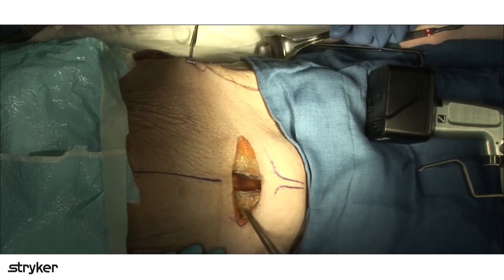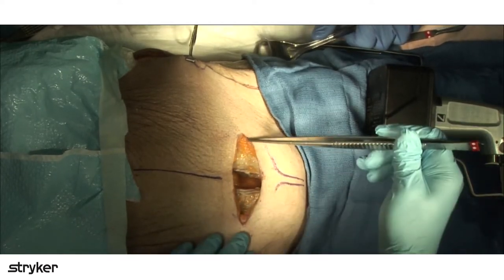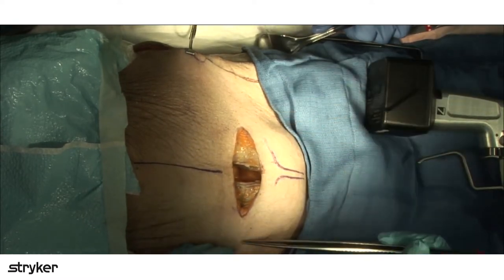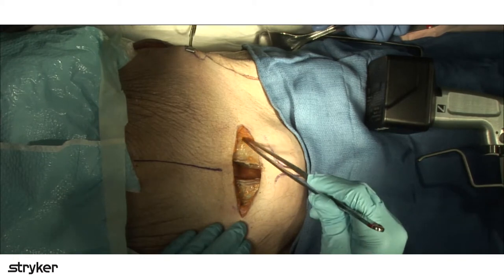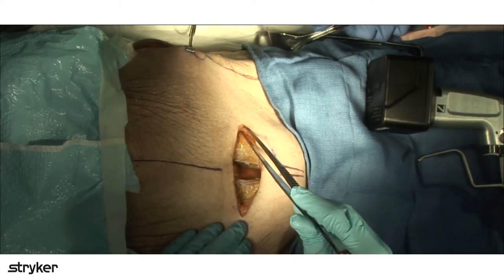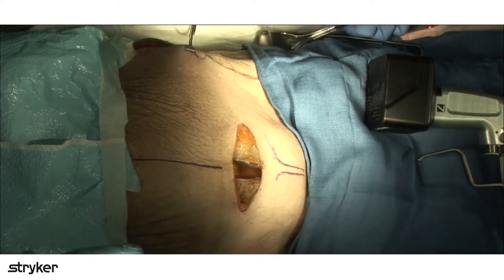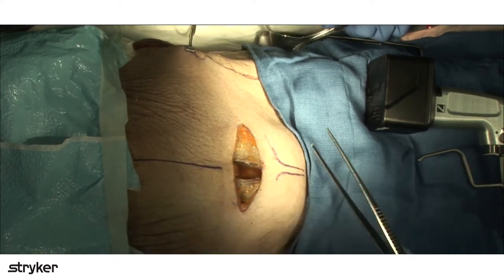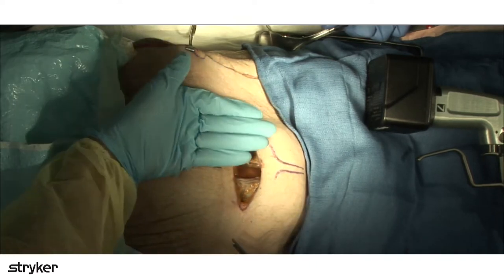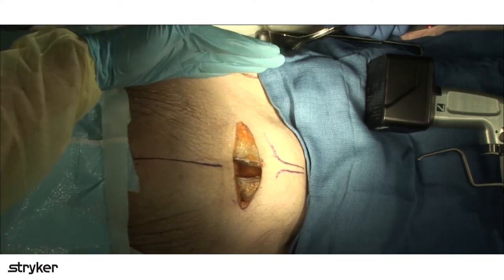When you do the incision, your exposure is not really predicated upon a really big, wide incision. At some point, if you keep going really wide, all you're going to get is the spermatic cord or the round ligament. Your ability to maximize your exposure when you do the AIP is taking the rectus from here and flipping it and getting it out of the way this way.